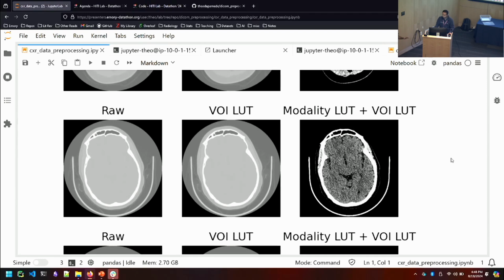You have to do this for every medical image. You don't have to do it for natural images because they're captured and processed, well, it's done by the camera, right? Natural light is processed, but that's what we're accomplishing here. I just want to make sure that that concept is not lost. Questions? Yes.